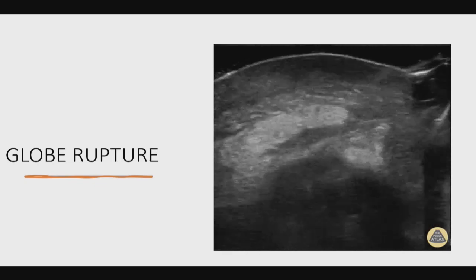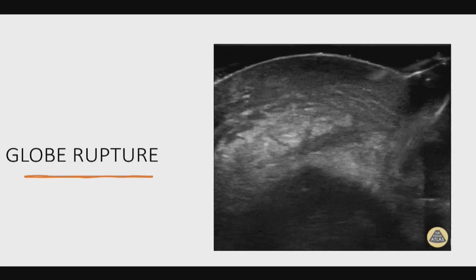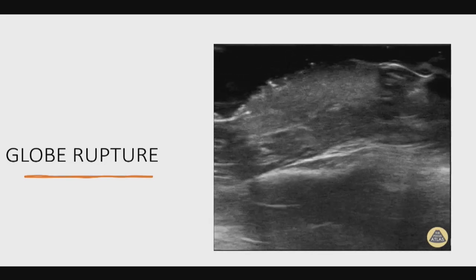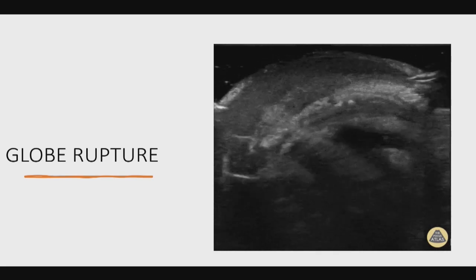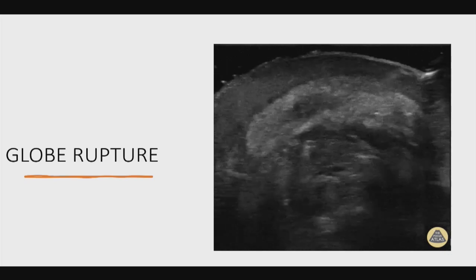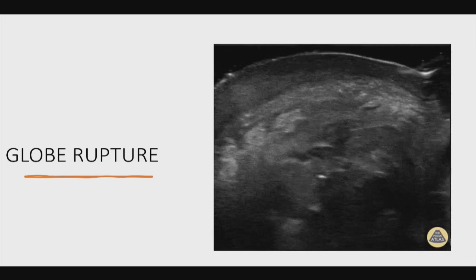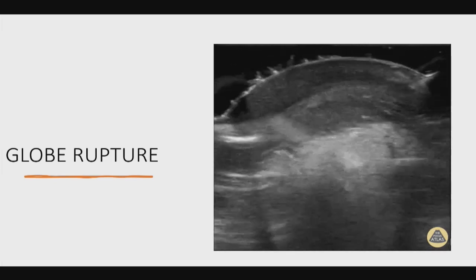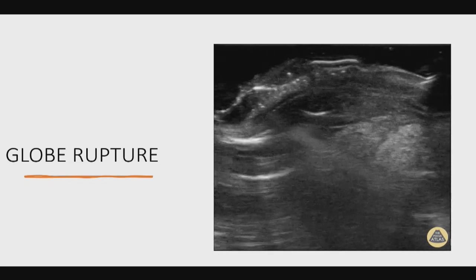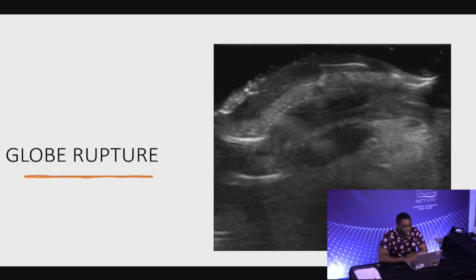Yes. So there's actually another technique. The other technique is not putting it directly on the eye. You can actually use the bone on the side where you're not applying increased intraocular pressure and you'll still be able to visualize the orbital structure. As long as the contraindication is pressure to the eye, if you can achieve that just by doing this, then you still get the same effect without applying pressure. And you can still do it in 2 views, but you're using the bone to protect and decrease application of pressure to the eye.